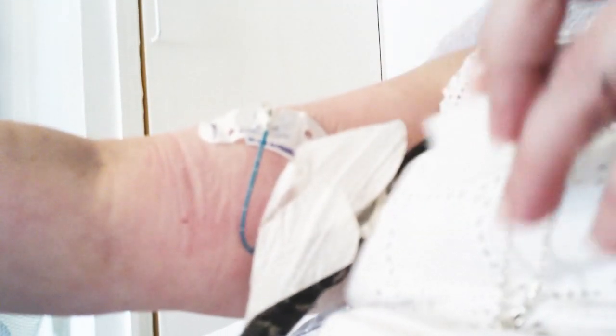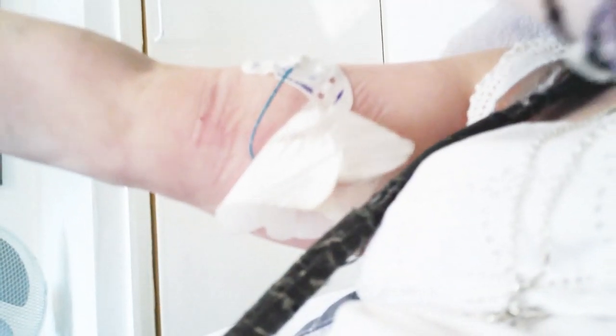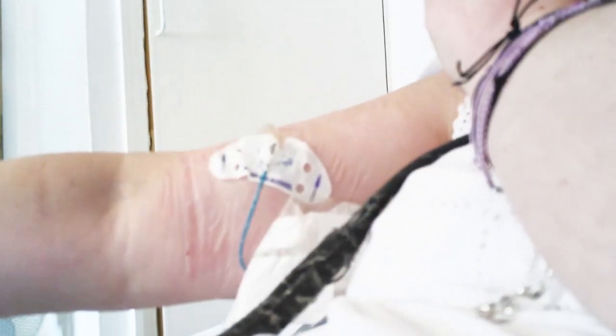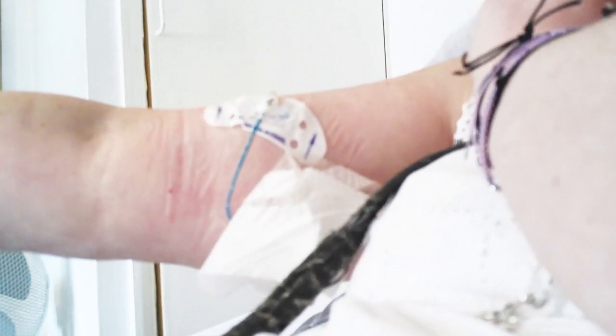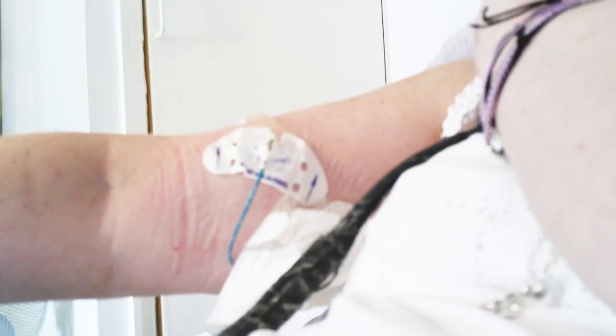My arm's pretty sore, look at that. It's a bit sore and it's a bit swollen, so you can get these problems, being swollen and sore with the tape on there all the time. I was going to change this StatLock, but actually it looks okay. It's fine, and it's not in the sterile area, so I think that will last another week, that StatLock.